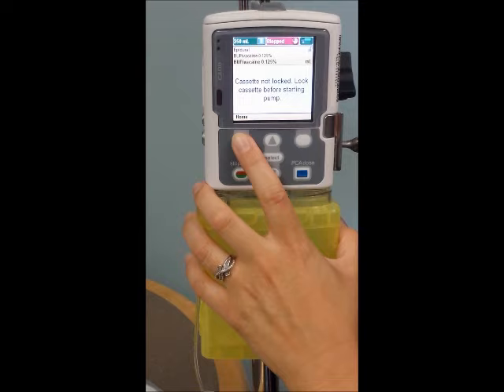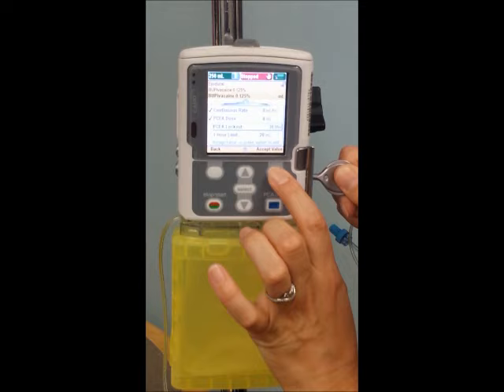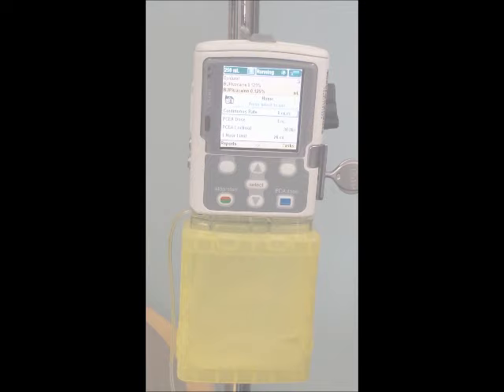You will lock the pump. It's going to ask you to review your settings. We are not responsible for changing these settings — this will be programmed by anesthesia. You will just need to accept by hitting the accept button. You'll get green checks next to each of the settings, and then it will ask you if you'd like to start the pump, and you will confirm. You can note at the top of the pump it will say 'running' to indicate that it is running correctly.